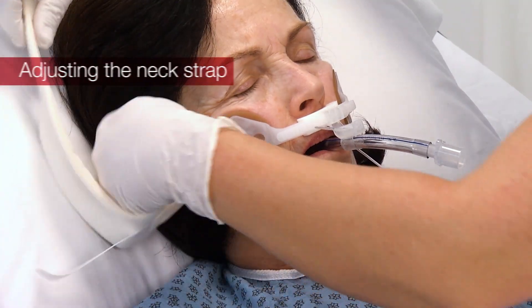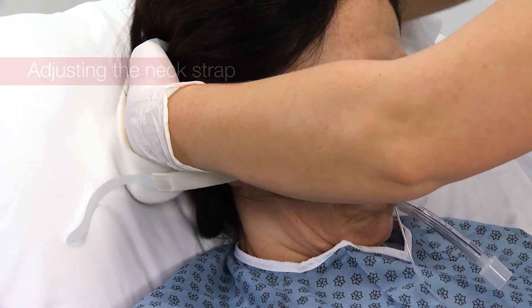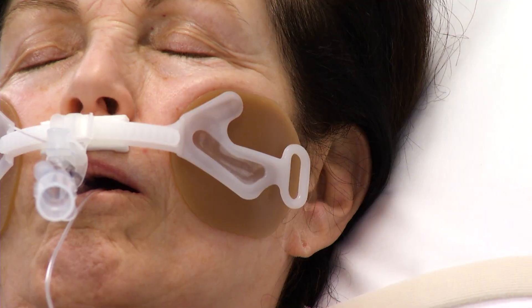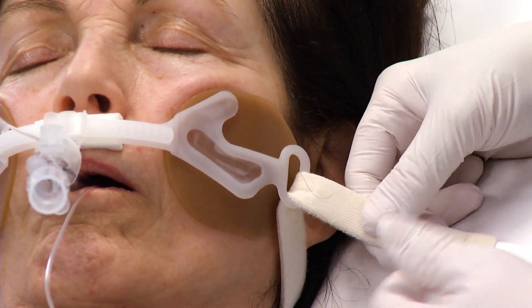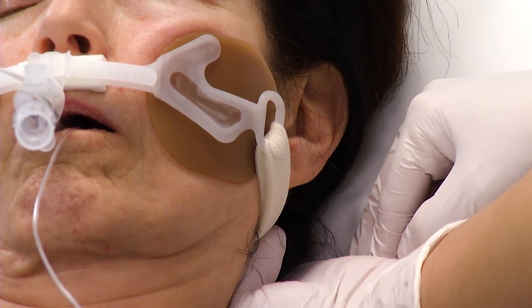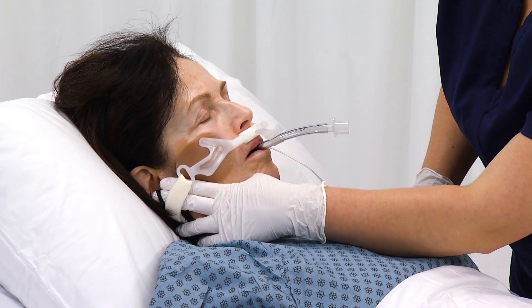Secure the neck strap by inserting the narrow end of the strap through the plastic loop on the track. Fasten the narrow end of the strap using the hook and loop closure. For greater comfort and security, adjust the straps on either side. Do not over-tighten. Allow two fingers width between the strap and the back of the patient's head.